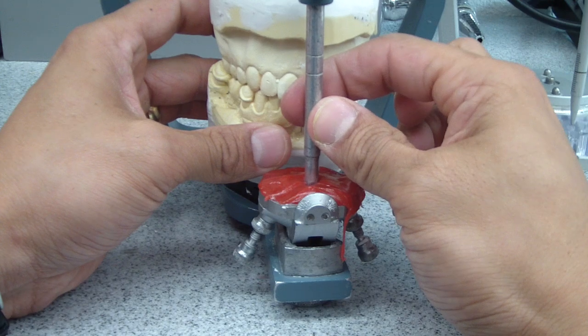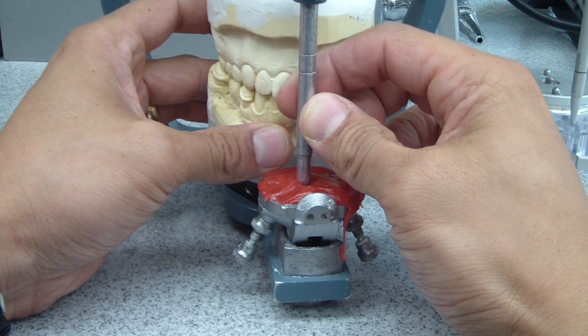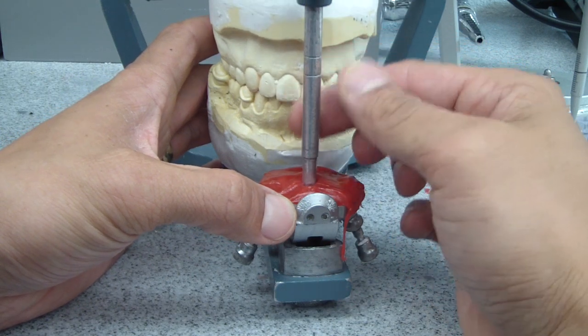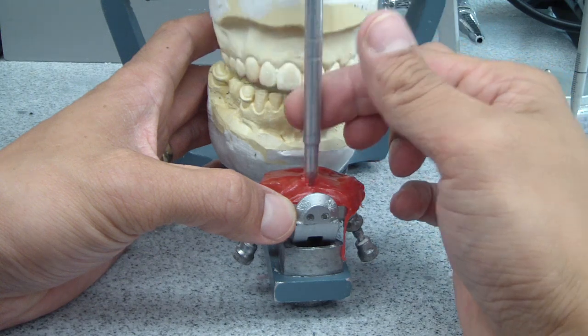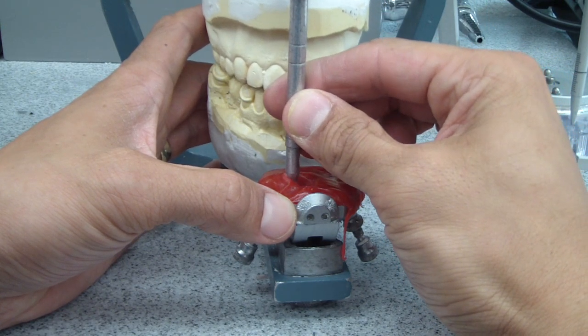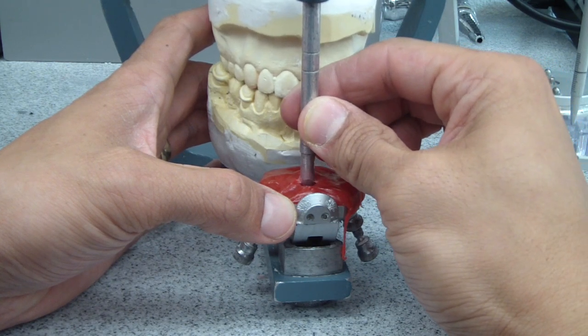It's sort of like being in an ocean of mud, but patience. One of the things as it starts to set — make sure you open and close the pin because it'll get locked underneath. Then we'll do a protrusive: lateral excursives and protrusive.